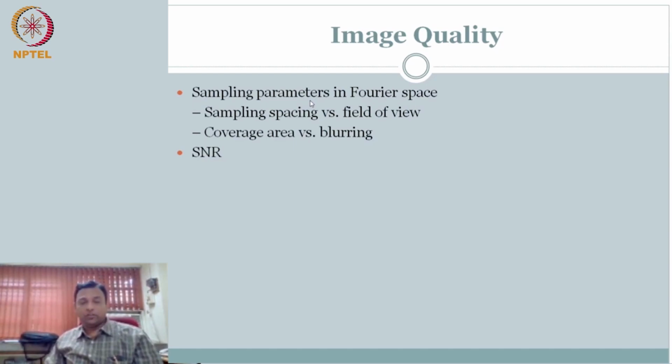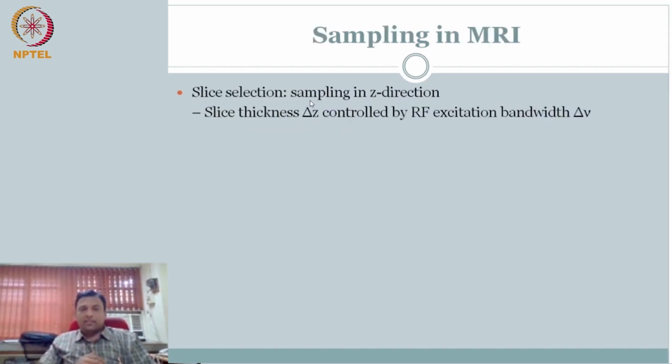And the challenge with resolution, so we'll spend considerable time even within this short module on the resolution part. The reason for that is everything is in front of the eyes. You think you understand, but to interpret it is a little confusing. So anytime something is confusing, you should really understand it to the core. That way you don't have to memorize anything. If you close your eyes and think about the concept, the definitions and the metrics should come out as a visualization for you. That is the aim that I have. Resolution is tricky. You might feel like it's straightforward, but it can get you confused.